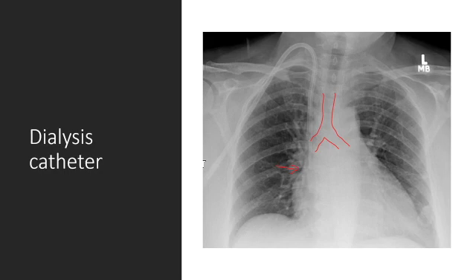If you cannot see the cavoatrial junction, you can find the carina and count two vertebral bodies below that to approximate its level. Practically anywhere within the SVC would be appropriate. Sometimes you see catheters extending into the right atrium — that's not ideal because it can cause arrhythmias.